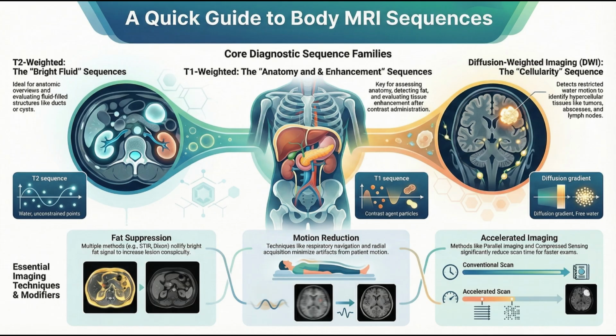Imagine telling a patient they have exactly 31% hepatic steatosis without a single needle. That's precision medicine. And we could do something similar for fibrosis with elastography. Right. Elastography measures tissue stiffness. We use a little acoustic driver, like a paddle, on the patient that sends shear waves through the liver, and the MRI machine measures how fast they travel. And a stiff fibrotic liver means faster waves.